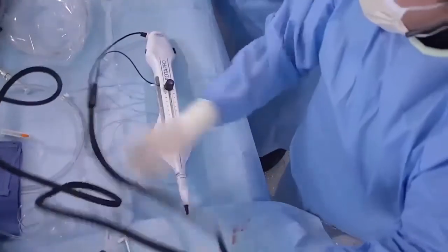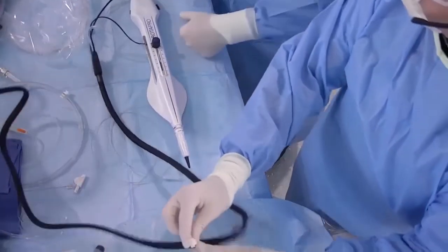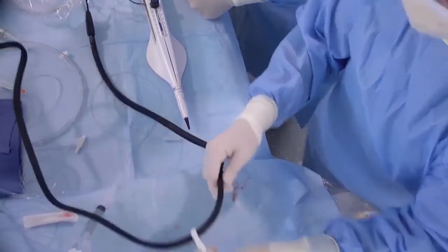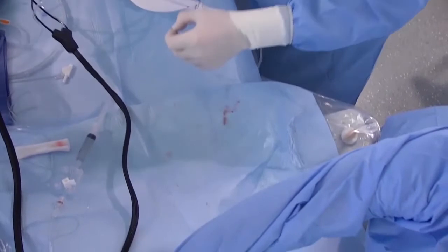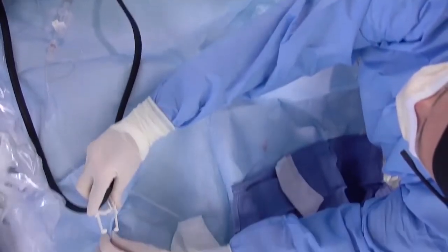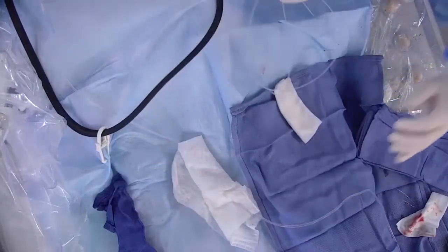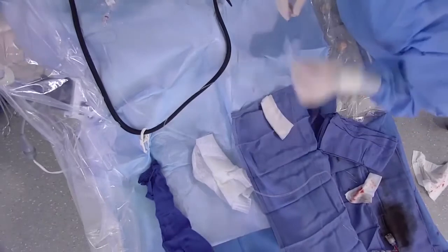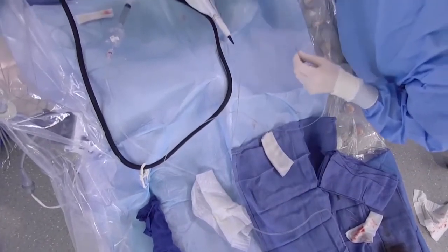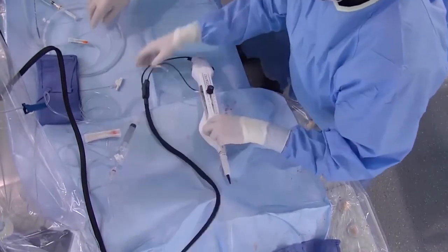So I will start by using this, and I put the clip, as you can see here, and I advance the burr in this part. As you can see here, I will clip here. So the new cable is quite bulky, and you just need to make sure it's well out of the way and doesn't get involved in the mechanism.